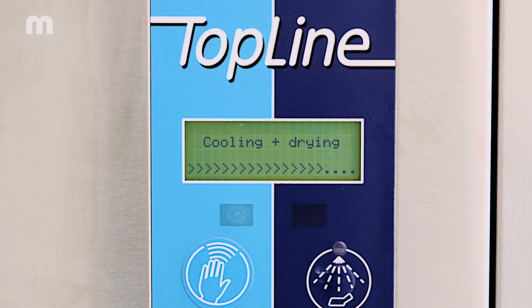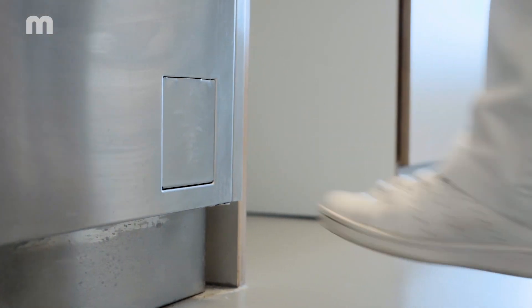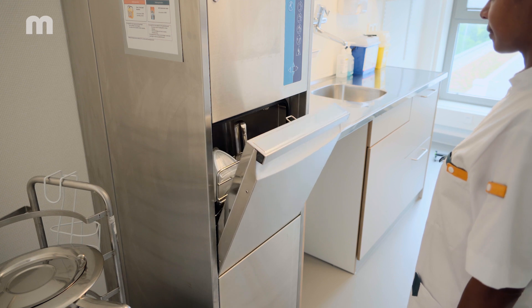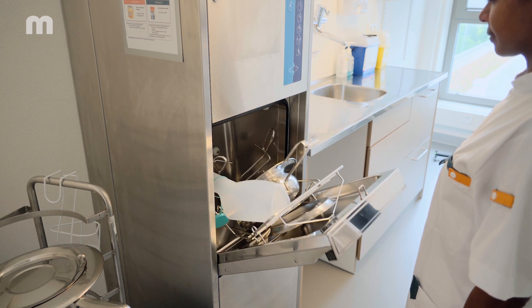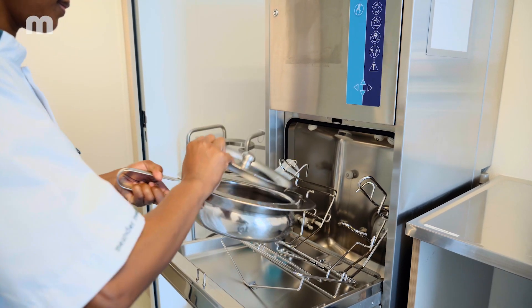The AO value is adjustable and can be set from 60 to 3000. Once the cleaning process is completed, you can open the door, take out the cleaned and disinfected care utensils and close the door again, by using the foot switch or holding your hand up to the sensor.